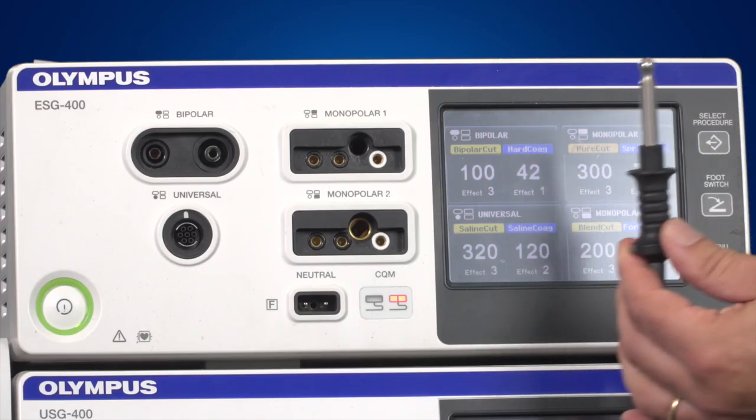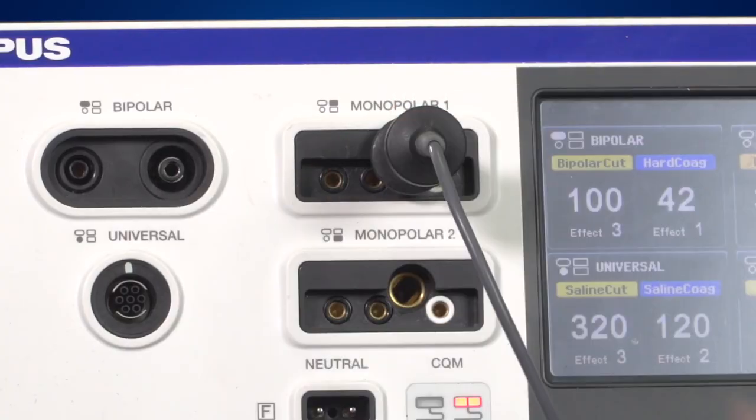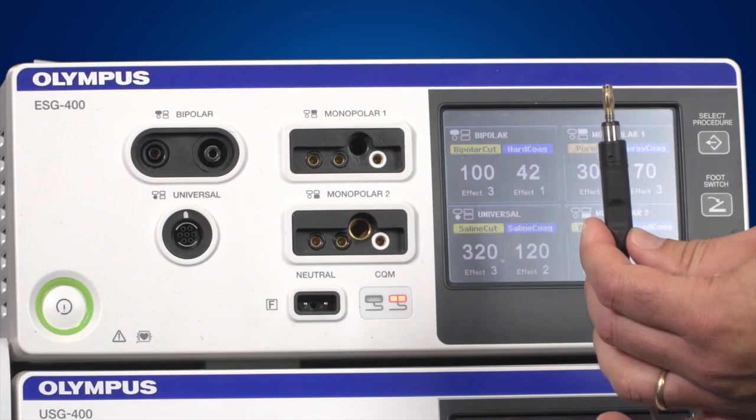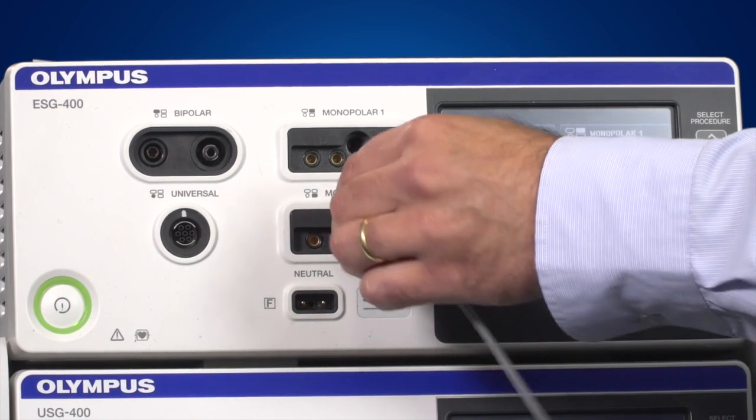The 8mm Bovee plug gets connected to the central socket in the Monopolar 1 connection area. The monopolar Irby type plug gets connected to the central socket in the Monopolar 2 connection area.